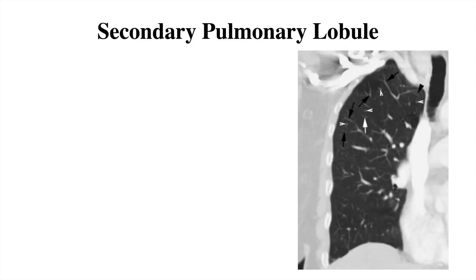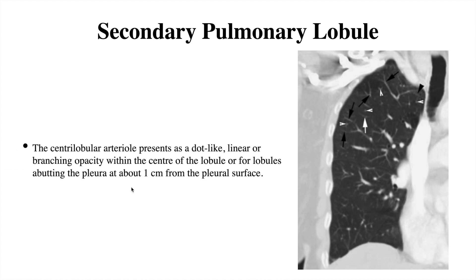Coming to the secondary pulmonary lobule as seen on CT: the centrilobular arteriole presents as a dot-like structure, visible as a dot with linear or branching opacity within the center of lobules, or for lobules abutting the pleura, about 1 cm from the pleural surface. You can see these dot spots surrounded by the interlobular septa.